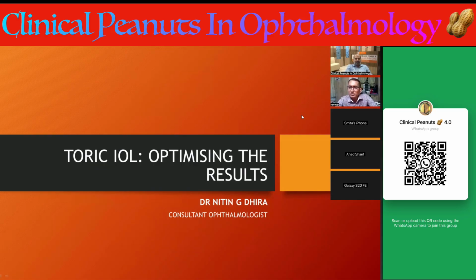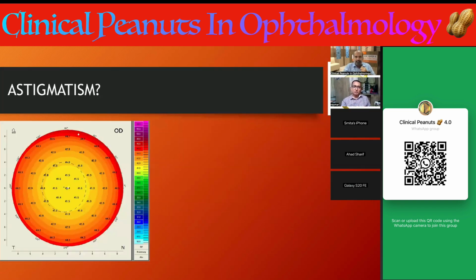Okay. Thank you, Anuj, for a nice introduction. It's indeed a pleasure and honor that I'm presenting today on astigmatism and toric IOL. So what is astigmatism? Whenever we do cataract surgery, we try to replace the refractive component. So in plain cataract surgery, whenever you are putting the normal IOLs, we are replacing the spherical equivalence of the cataractous lens with whatever power by biometry, and that is the usual cataract surgery.